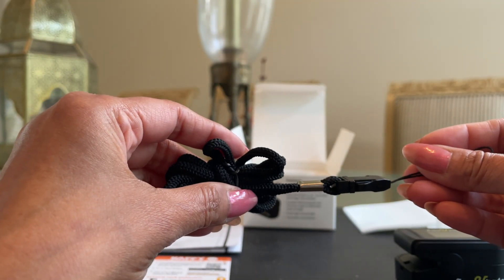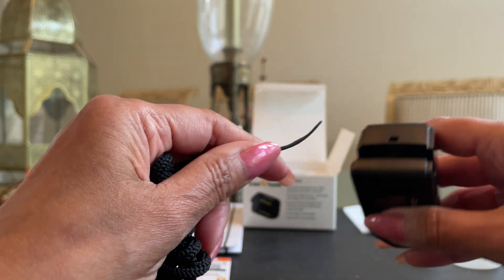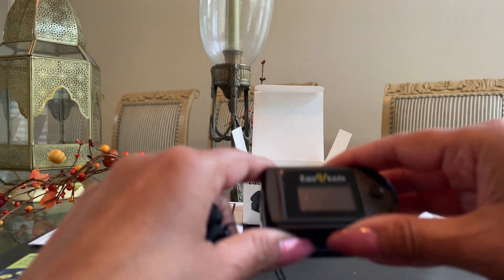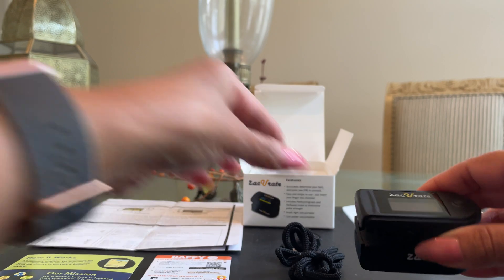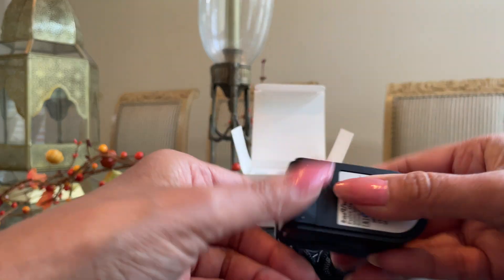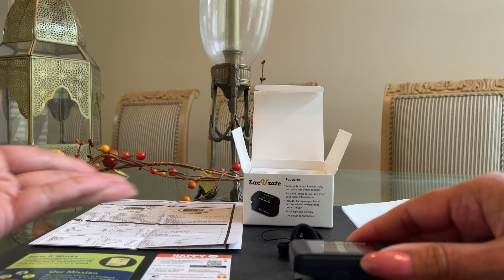For avid exercisers, you can use the lanyard as a necklace to check your oxygen level at rest. You thread it through the hole and wear it as a necklace, checking at the end of your exercise while at rest — not during exercise, at rest. So in total, this box comes with a silicone cover, a lanyard, two AAA batteries, the pulse oximeter itself, and the user manuals.